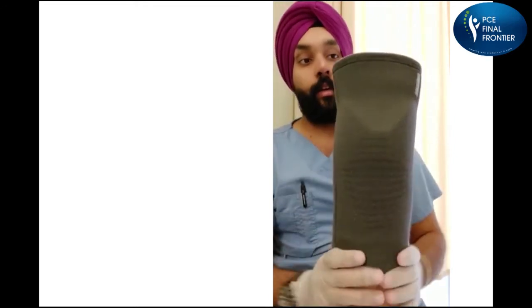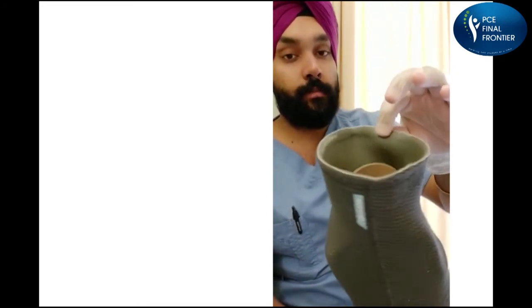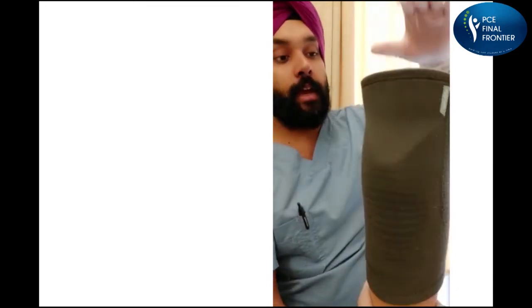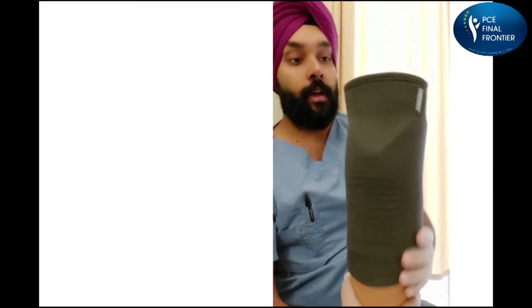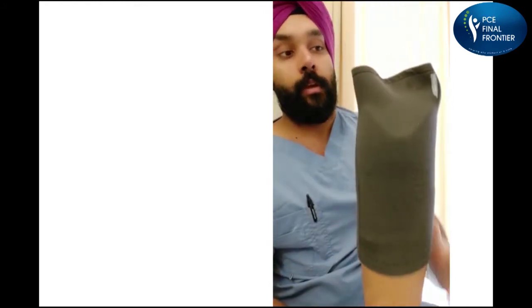All right, so this is a different suspension. It doesn't have a Velcro. It just gets stuck with the liner of the patient. The patient has a liner, which mostly looks like this, but a little thicker than this. So the liner goes on the leg and this suspension sticks with the liner and it does not allow the foot, the leg, to drag down. Okay, I'm pulling it, but it's just not moving.